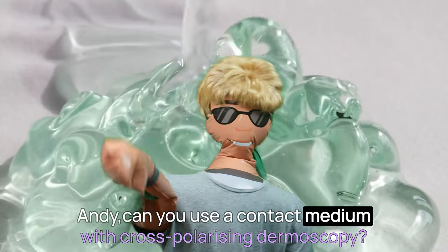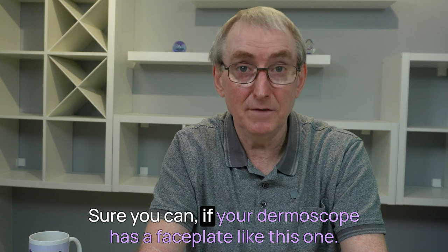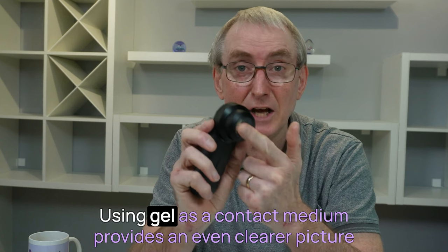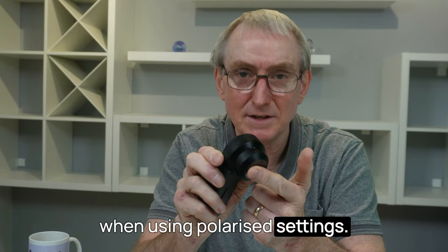Andy, can you use a contact medium with cross-polarising dermoscopy? Sure you can, if your dermoscope has a faceplate like this one, because some polarised dermoscopes don't. Using gel as a contact medium provides an even clearer picture when using polarised settings.